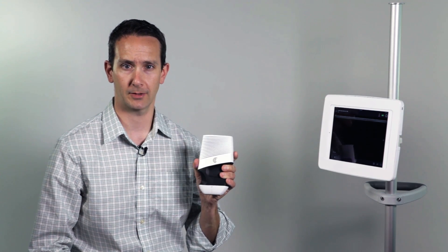My name is Chris Eddy. I'm an ultrasound educator. Today we're going to be assessing the Achilles tendon using the Clarius ultrasound scanner.